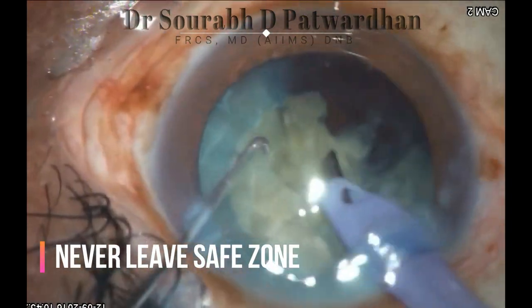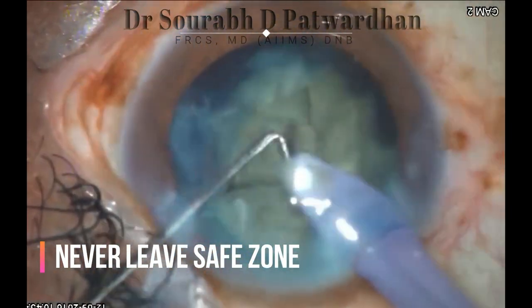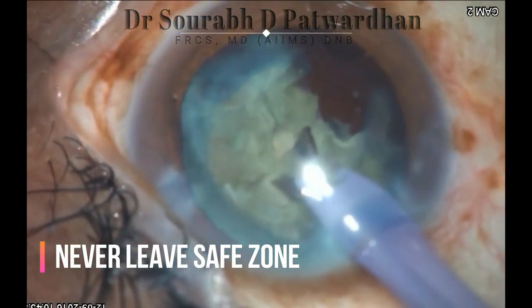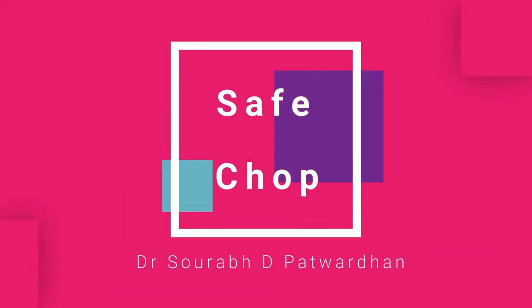You can see here the surgeon tends to go away from the safe zone occasionally. Though the surgery might be uneventful in most cases, there will be a high risk of posterior capsule rupture — like in this case where the surgeon left the safe zone and caused a punch in the posterior capsule.